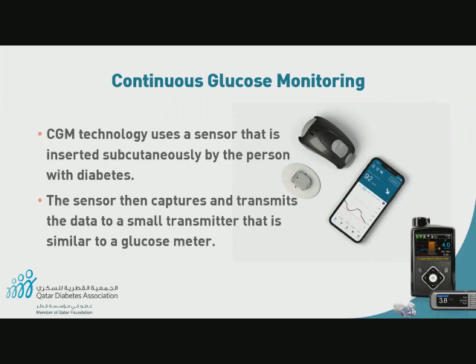It keeps sending the results 24/7. For people using an insulin pump, the pump comes with a sensor and also keeps measuring the blood glucose continuously.